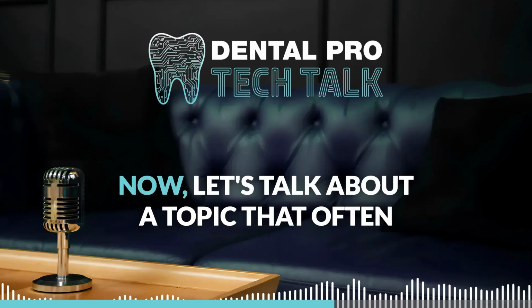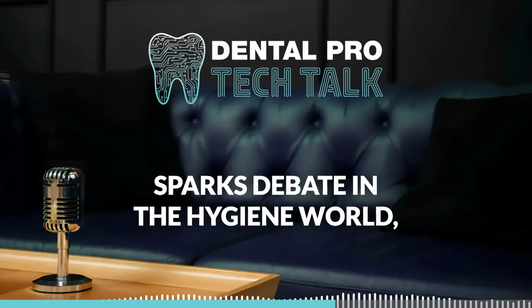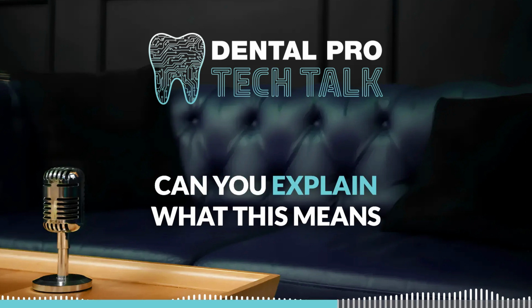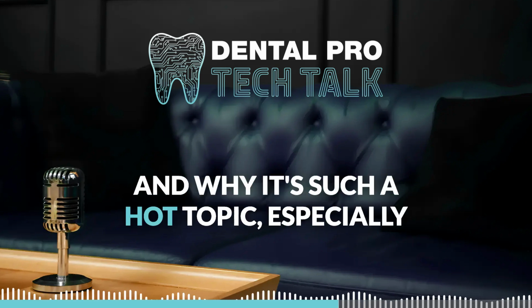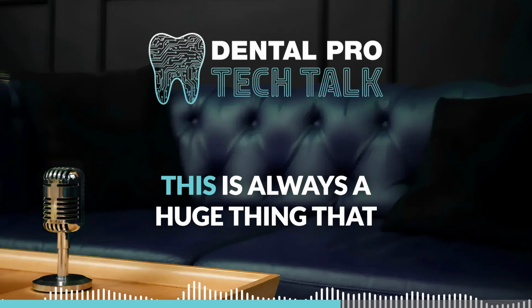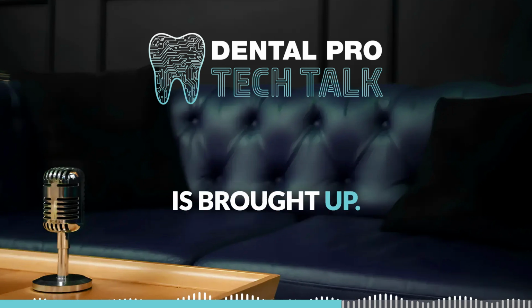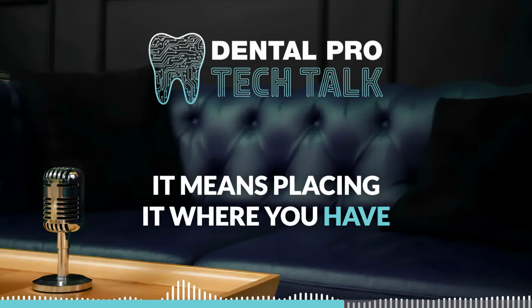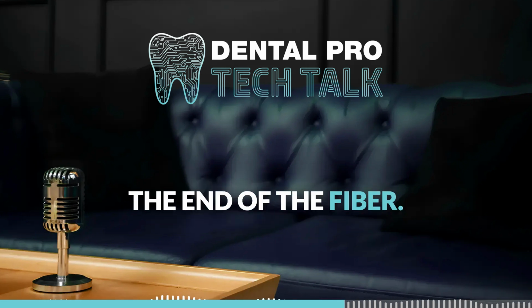Now, let's talk about a topic that often sparks debate in the hygiene world, initiating the laser tip. Can you explain what this means and why it's such a hot topic, especially for hygienists? Do I need to initiate the tip? This is always a huge thing that is brought up. First of all, what does initiating the tip mean? It means placing it where you have something dark that is placed on the end of the fiber.